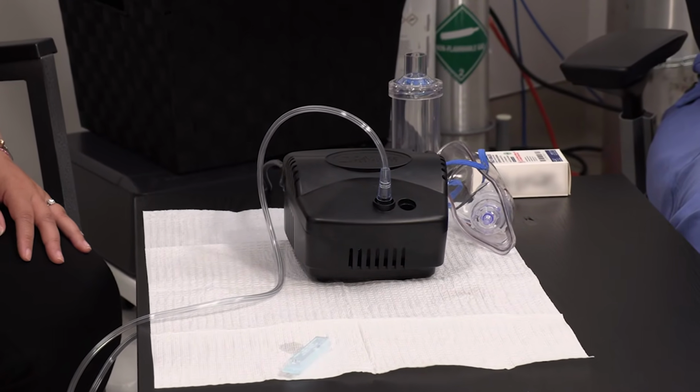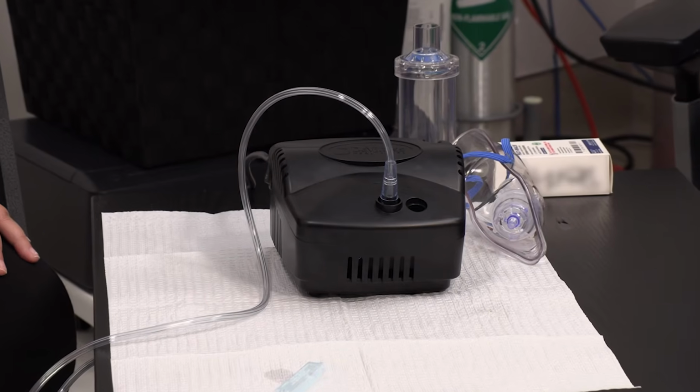Remember to use your nebulizer machine consistently for optimal control of your asthma symptoms.